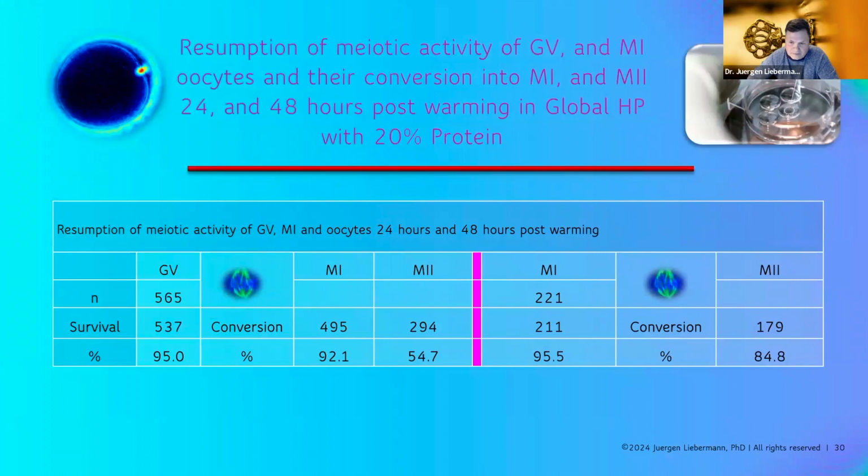I did the same with the metaphase 1. I kept them for 24 hours only in culture. And after a nice survival of 95.5%, about 85% of them converted to metaphase 2.